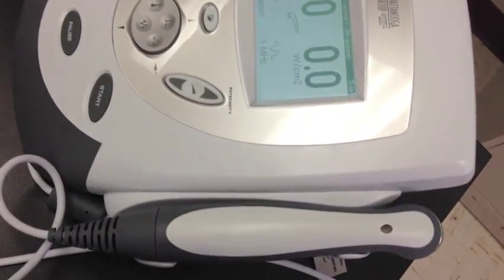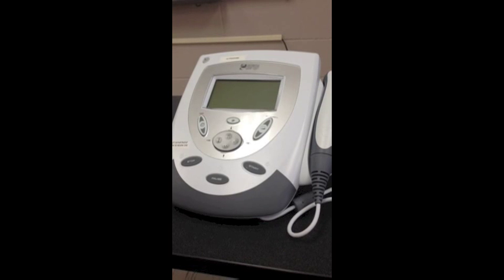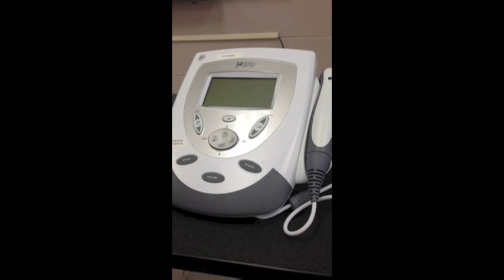After the treatment is finished, you just want to make sure that you clean off the patient's skin. Suggested occupations. After ultrasound, engage the client in teaching and practice of joint protection techniques for RA, OA, and or back pain during cooking, typing, and laundry.